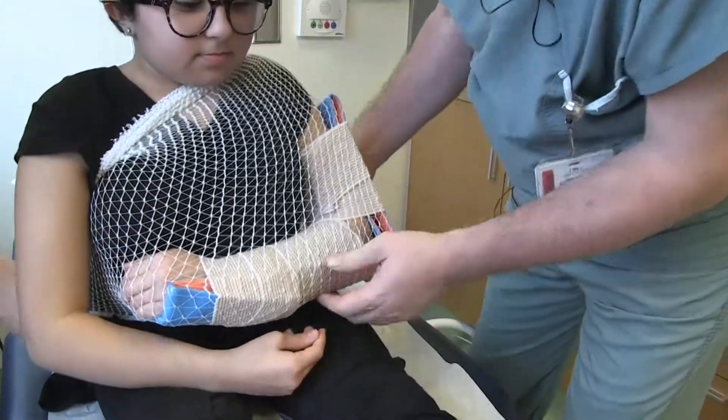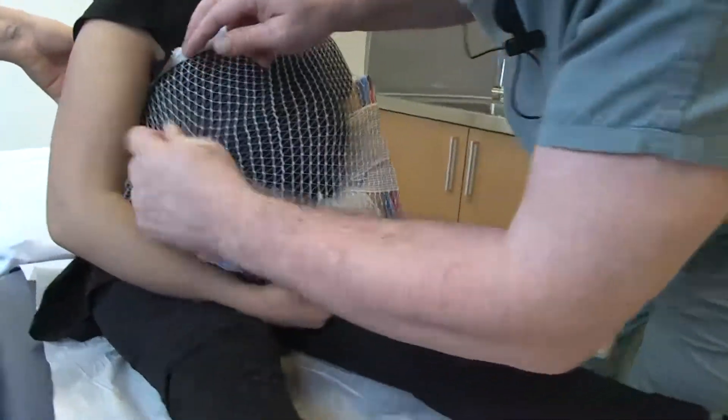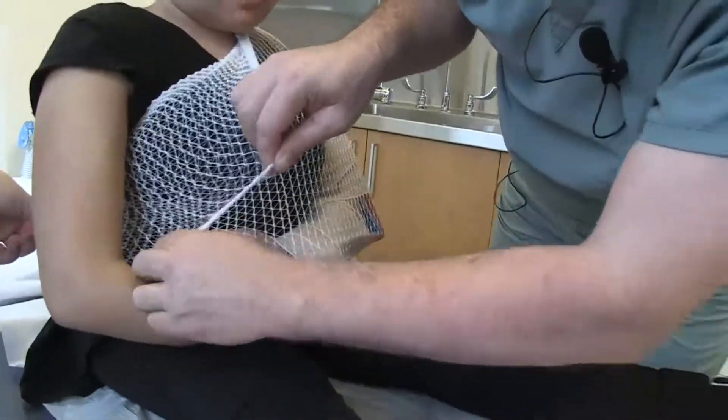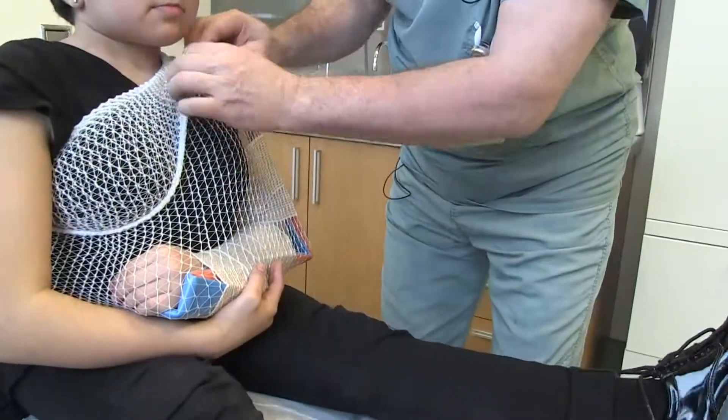And from here, it should hold in place. Does it cut here underneath? No. So if it were to cut, we could pull down the part that bothers the patient.